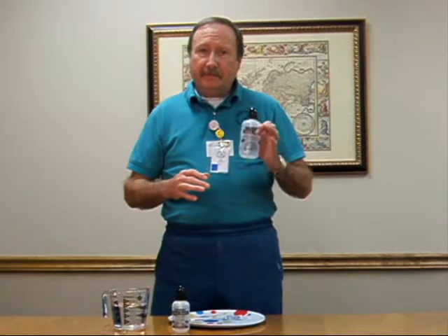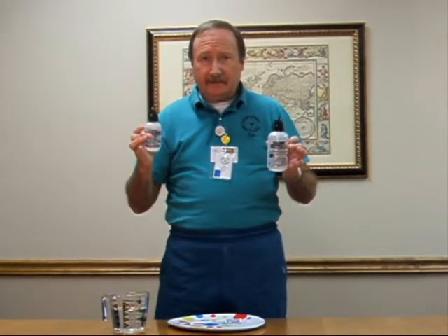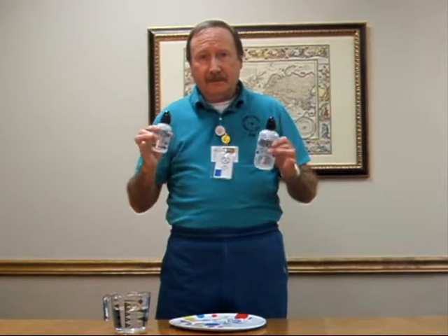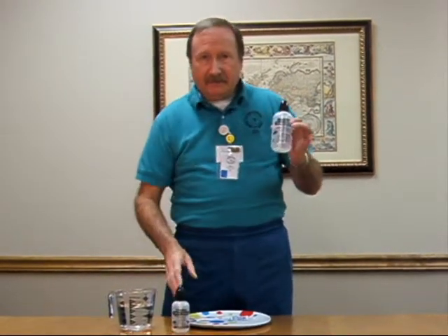Today we're going to demonstrate the nasal rinse. If your doctor is talking to you about the benefits of a nasal rinse, either for you or for your child, there's a 4 ounce for your children and 8 ounce nasal rinse for the adults. This is what it's going to look like.